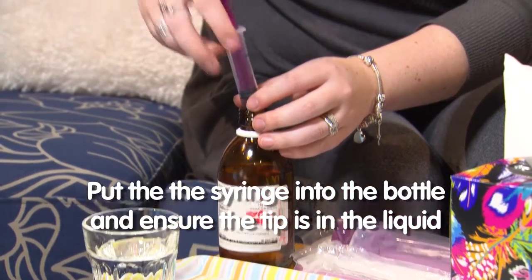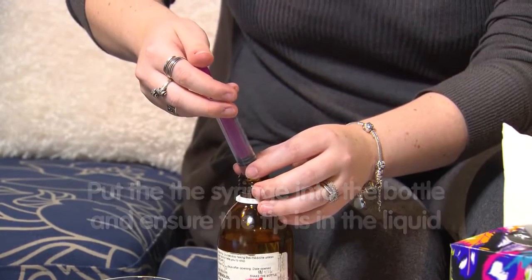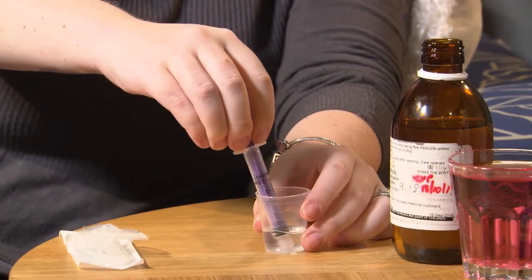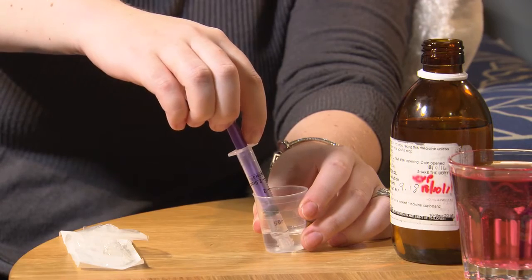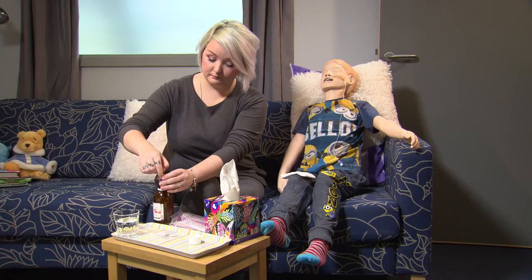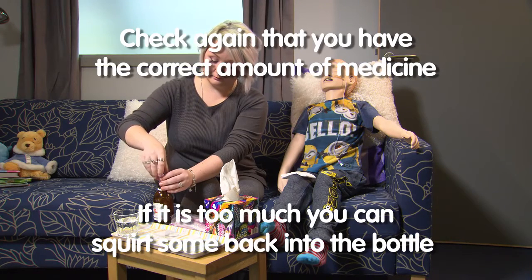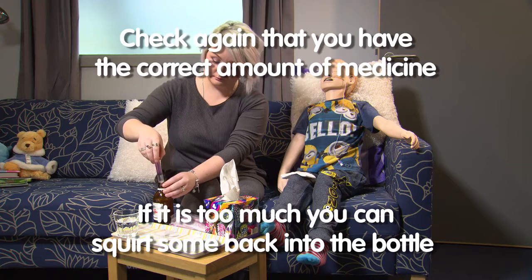Pull the plunger back until you've drawn the right amount of medicine into the syringe. Alternatively, you can pour a little of the medicine into a measuring cup and draw up the amount you need from there. You need to check again that you have the correct amount of medicine. If it is too much, you can squirt some back into the bottle.